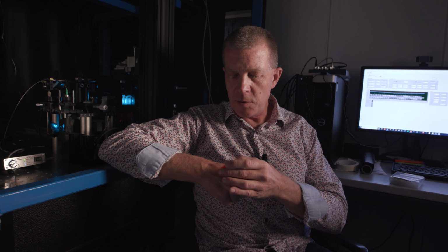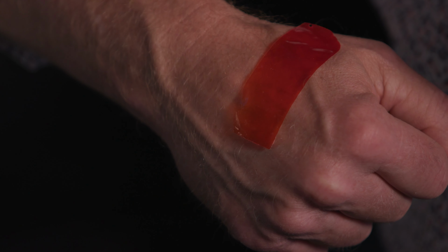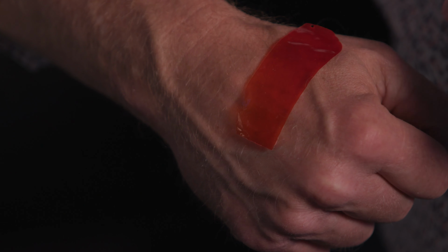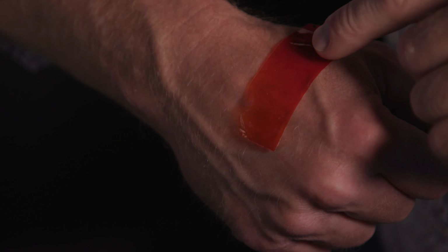And even though the films are very thin, they can actually develop a specific tension, or you could say force per cross-section, which exceeds that of the human muscle tissue. But as I said, the films are very thin, so only 10 micron, and that means that we need to form a stack of alternating layers of films and light-emitting diode arrays, which will actually illuminate each of the layers of the LCE film to make them contract. And when they contract, they basically can either support the cardiac contraction or they can replace, you could say, a non-contractile part of the heart.